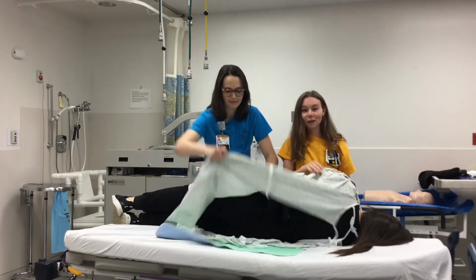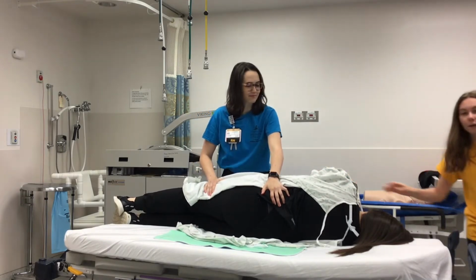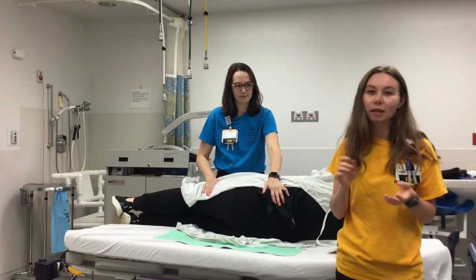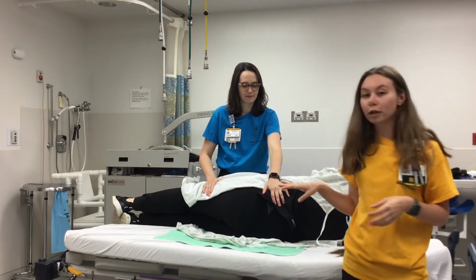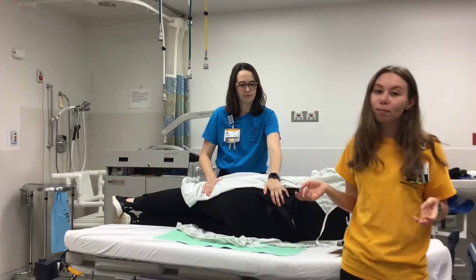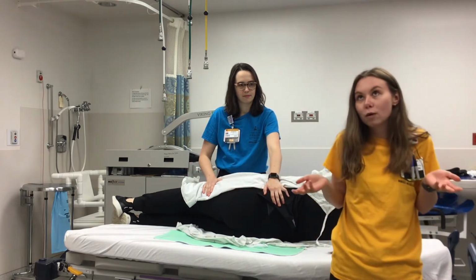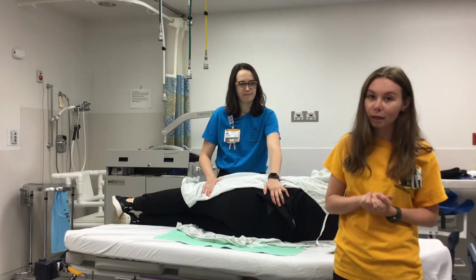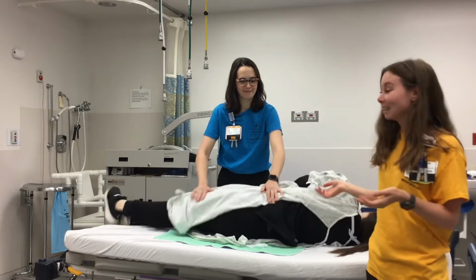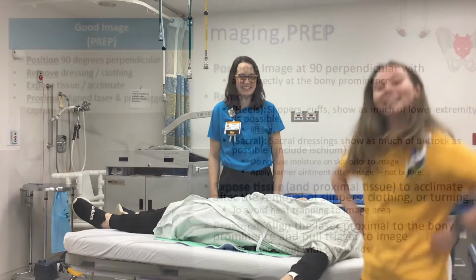Now that she's turned, we're going to make sure this patient has no dressings or any other clothes anywhere. Make sure she doesn't have any skin products on, like lotion. And then we want to make sure her body temperature is appropriate for the Wound Scout, which is about room temperature. The main bony prominence areas are the sacrum and the heels, but with the Wound Scout you have options to add other bony prominences. We also want to make sure this patient is stable, which she clearly is. And that's how you set up a patient for the Wound Scout.